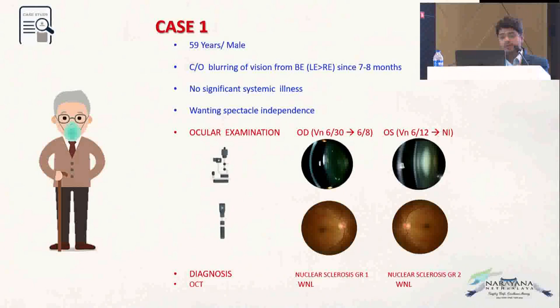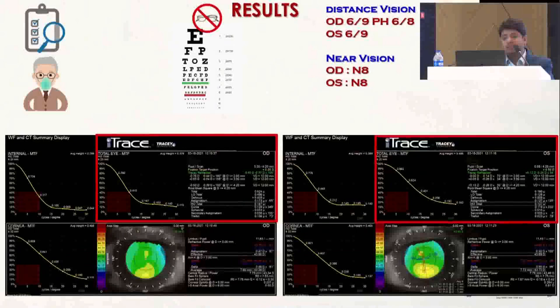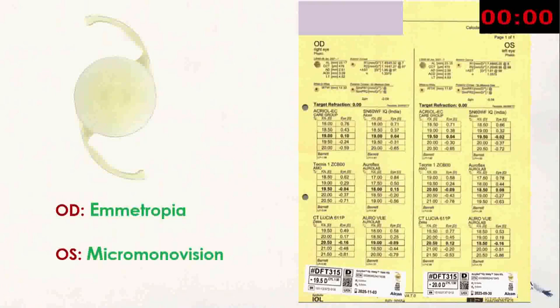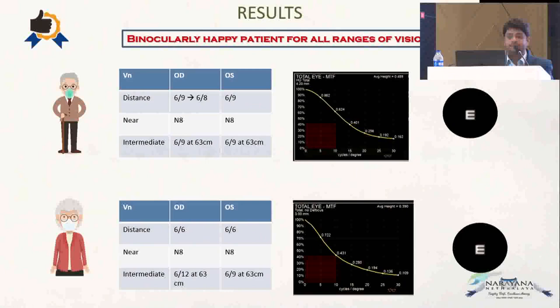So this is a case which was normal. We planned emmetropia in one eye and the patient wanted near vision as well. So we went ahead with a Vivity lens and we planned micro monovision in the other eye. And the patient ended up having good vision across all range of distances. And this is another patient where we planned a toric lens in the other eye with a Vivity with micro monovision. And this patient also had good binocular distance, intermediate and near vision and was happy for all range of distances. Thank you.